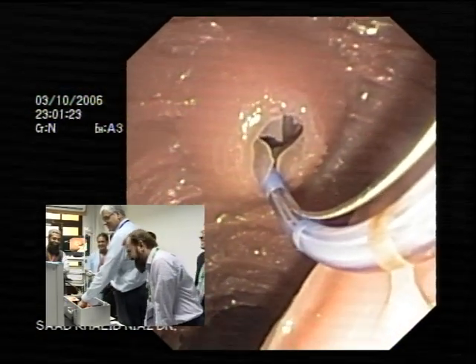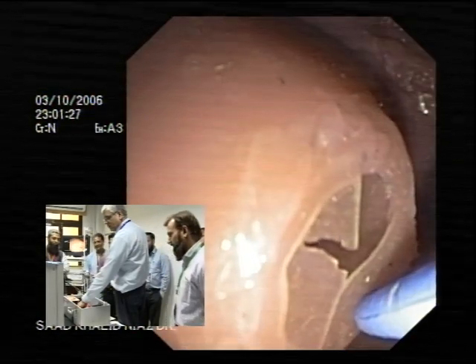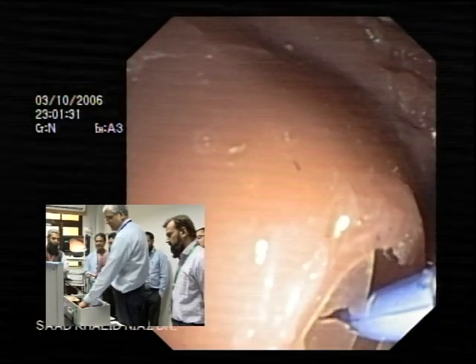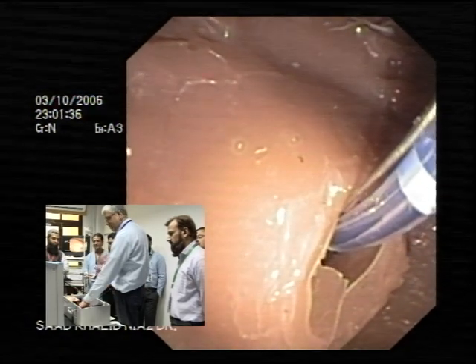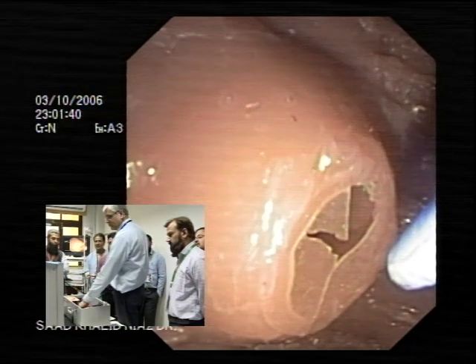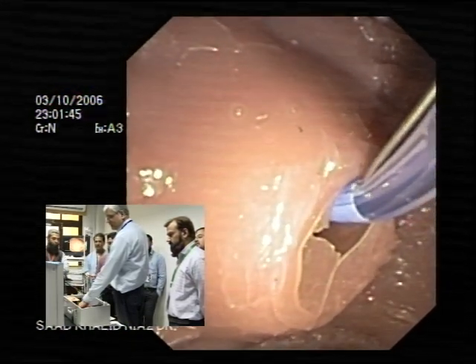Pull back. Pull this thing up. Okay. Now bring yourself. Now go up. Go. No. Elevate your thing. You need to go. Elevate. Thoda aur elevator se elevate kare. Aap to andar jaane ke baad kare na. So that's not going to help you. So you need to elevate before you go in. Go in now. Now go in. Slowly go in. Ab elevate karo.